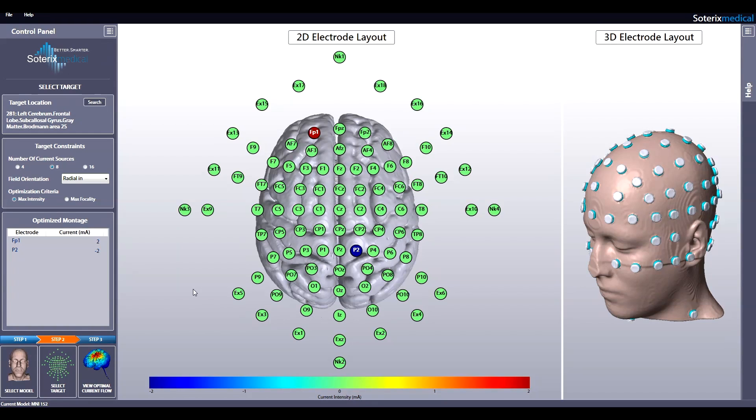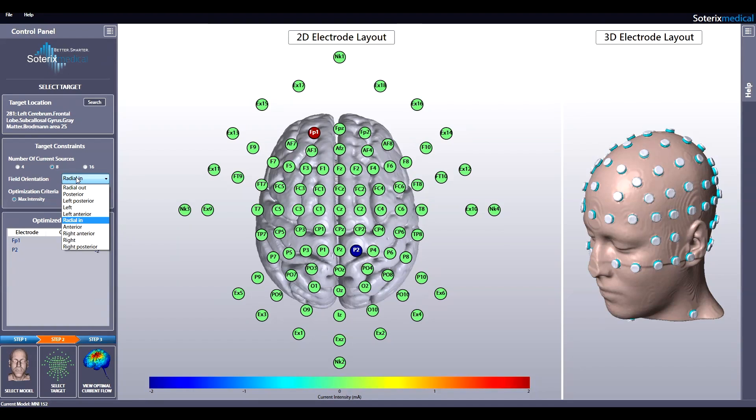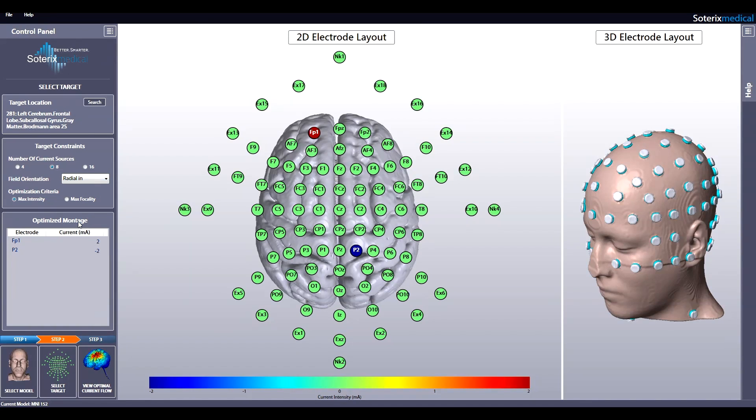Next, select your constraints starting with the number of current sources. This is determined by the HD stimulator that you have. If you have the MXN stimulator with 8 channels, select 8 channels. Next, select field orientation. For example, select radial in if your target is superficial since pyramidal neurons are predominantly oriented normal to the surface.